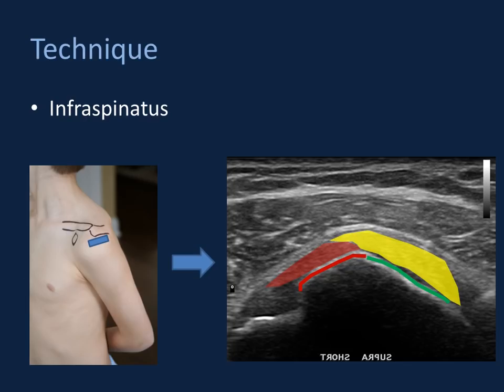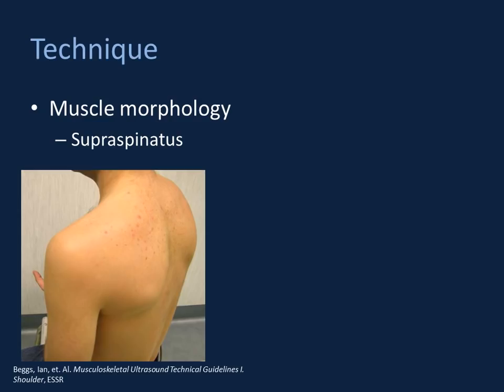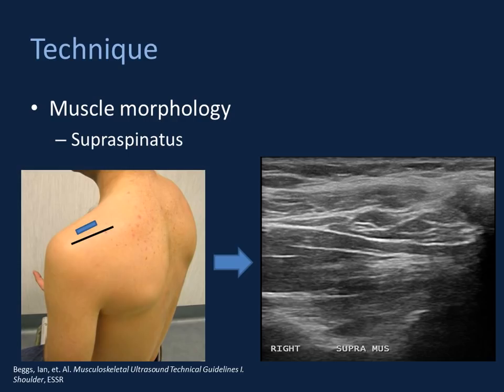Moving to another important point: much as with MRI, it's useful for your orthopedic surgeons to know how atrophied tendon tissue is if there is a tear, as this affects the ability to repair it. Our marker for identifying muscle morphology for the supraspinatus, infraspinatus, and teres minor is the scapular spine — easily palpable in most patients. Placing our probe parallel to the scapular spine, we should be immediately over the supraspinatus fossa, seeing characteristic muscle architecture: hypoechoic tissue with alternating bands of increased echogenicity representing fascial elements, with some overlying trapezius tissue.